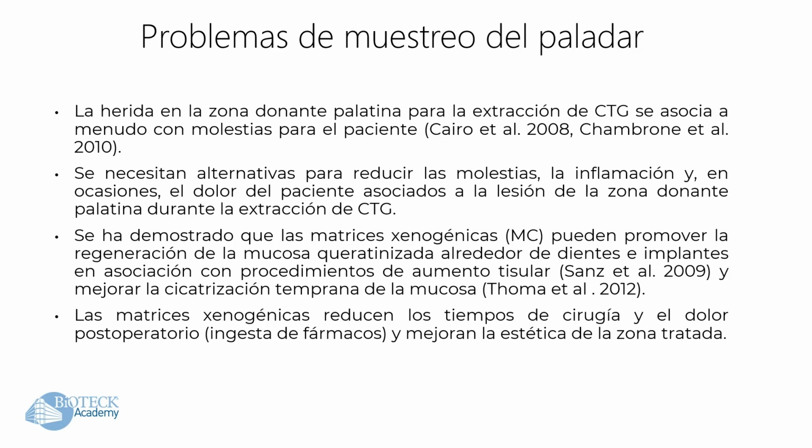Over the years it has been demonstrated that xenogenic matrices can be used to regenerate the keratinized tissue of teeth and implants, associated of course with the techniques I mentioned before, the CAF or MCAF.